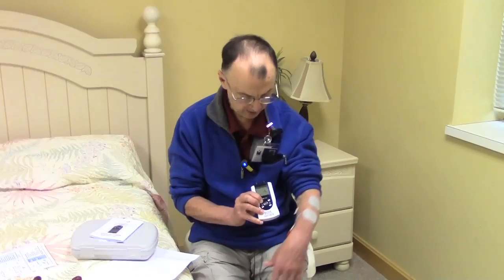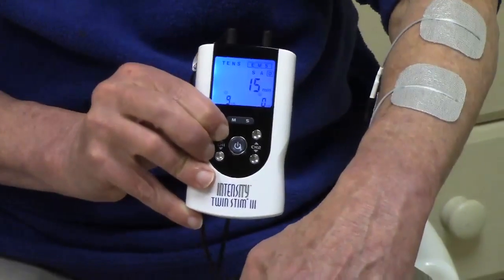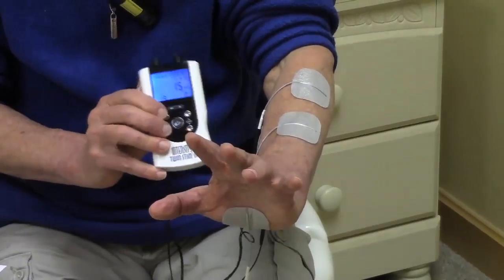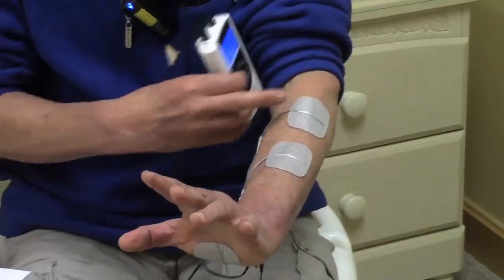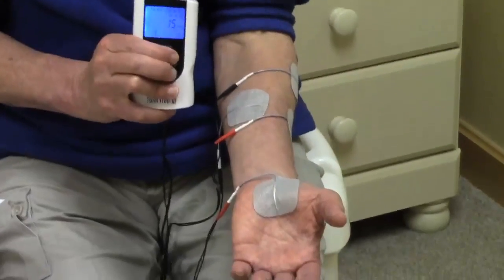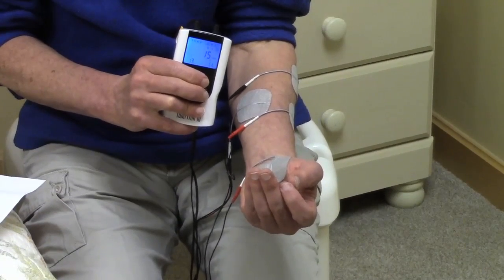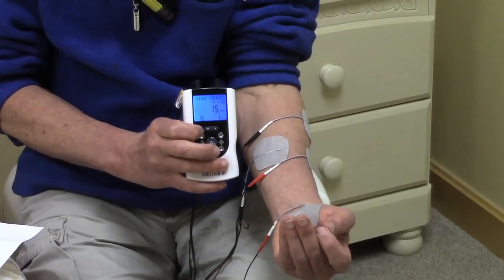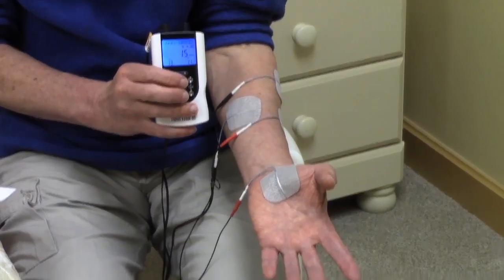I'm going to have my arm in position and start. At this point I can feel some tingling right under the electrodes. If I had this response with my patients I would be pleased — I've got a nice wrist extension, nice finger extension, and the thumb looks great. This looks like a good placement for the electrodes. As soon as this relaxes, I'm going to stimulate the muscles that close my hand. Once the screen goes from blue to green it will go into its opening and closing routine. Right now it's kind of trying to do both at the same time, which is not what you want.